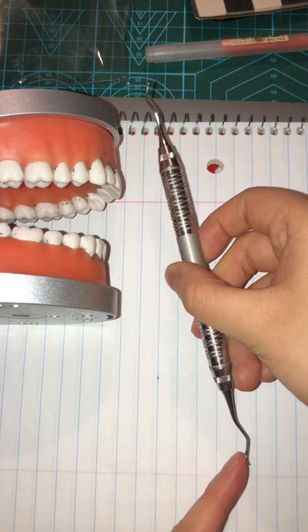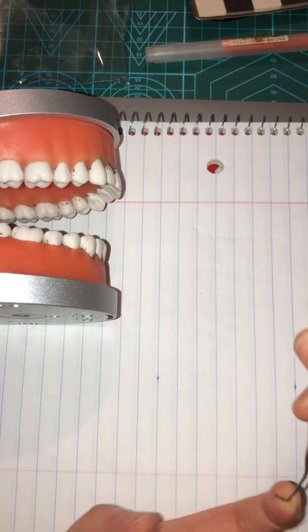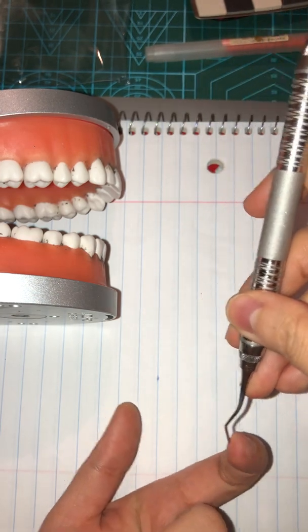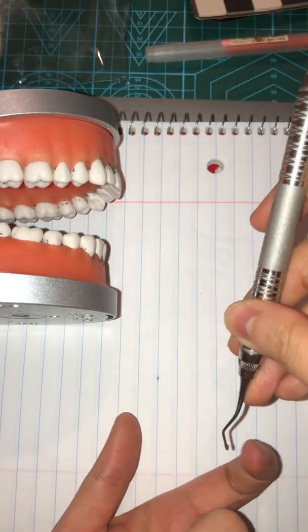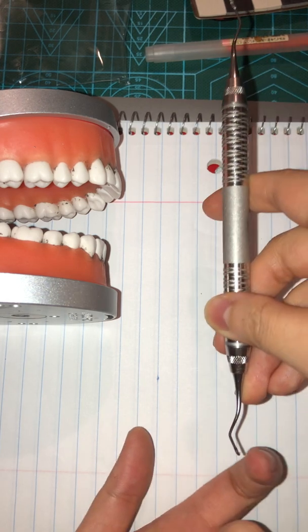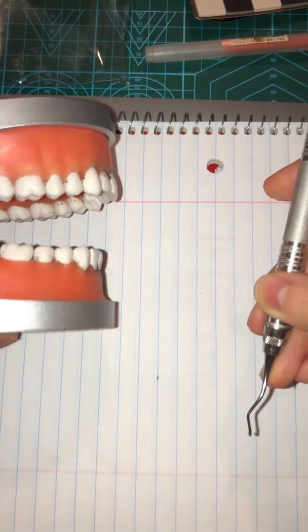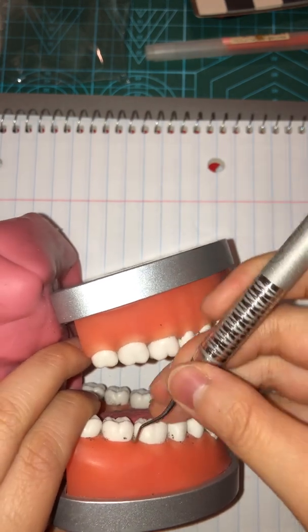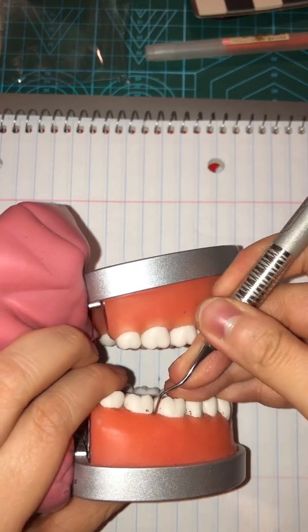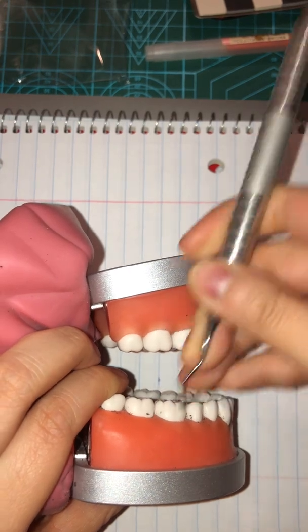And now when you turn it around, right, and you try to put it against the tooth, now because I flipped it, this side, which is lower, is going to be here when you're looking at it at this angle. So then when you position it onto the tooth, the lower side, which is over here, right, makes sense because 13-14 is for the distal. Okay.